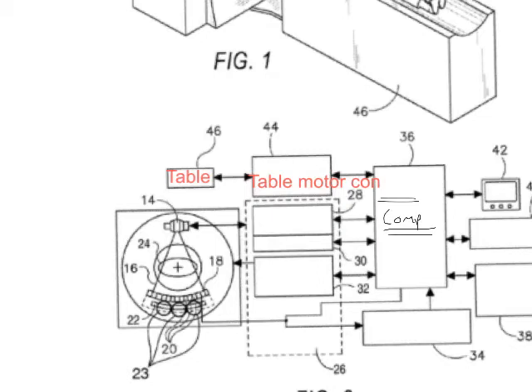So the computer also has, below the table motor control, an X-ray control, right? So this box 28 is X-ray control. Because we want something to control this thing. Like, I don't want to be out there controlling it, right? That would be a disaster. So 28 is going to be our X-ray controller. And right below it, I said I couldn't quite say where this thing was inside the gantry, but we've indicated there's going to be a high voltage generator, kind of hooked up to that X-ray controller, right?